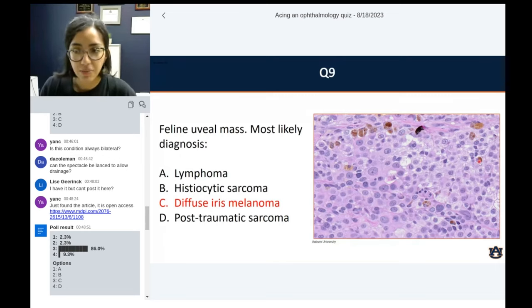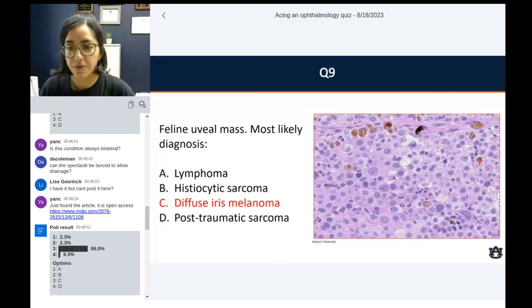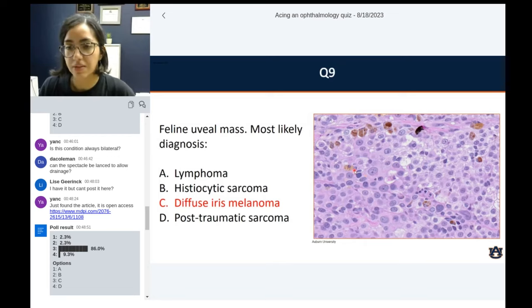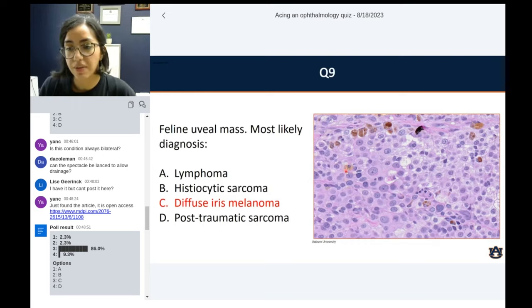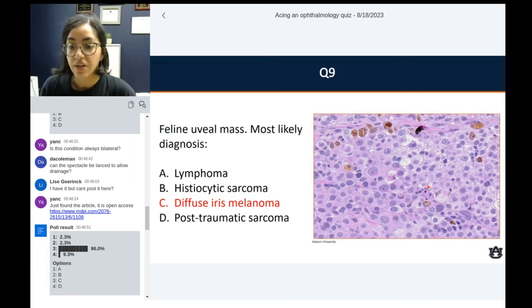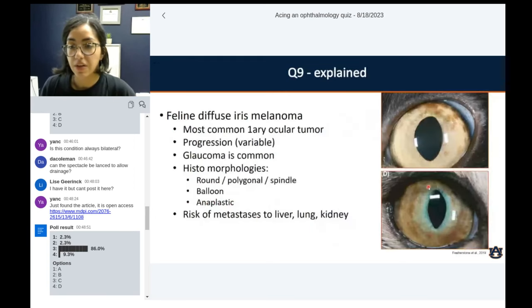You start to see whether the preexisting uveal melanocytes are just spread apart by the neoplastic cells, or these actual neoplastic cells rarely having cytoplasmic pigmentation. This nucleus is pretty round for just a melanocyte of the cat uvea — I think this is a neoplastic cell, a true neoplastic cell, with a little melanin-looking content. This is characteristic of feline diffuse iris melanoma, which can have multiple histological patterns: classic round, polygonal, spindle, mix and match, balloon or anaplastic.